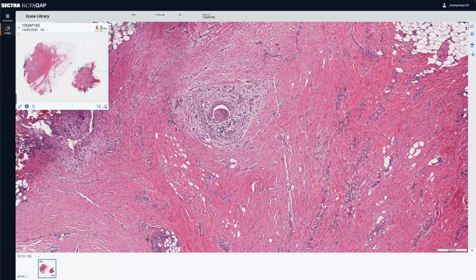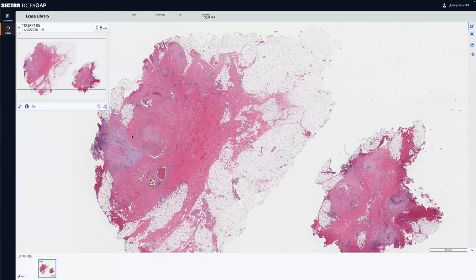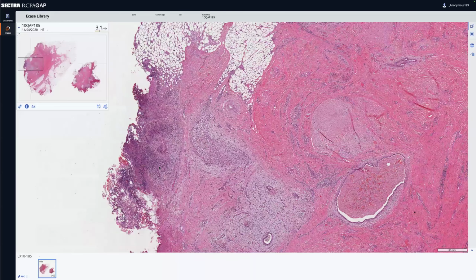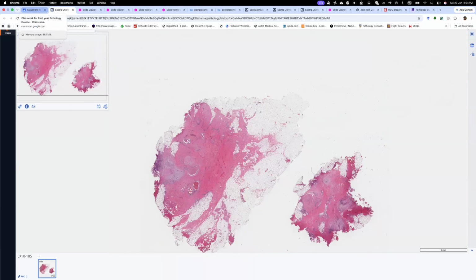I honestly think, you know how we have specimens that we think we don't need sending to us? I honestly think I don't need all the endometriosis. I think they're pretty good at identifying it by eye, but I also think that they somehow need a histologic diagnosis to get access to payment or medicines or something. Anyway, endometriosis. Okay, so here we go.